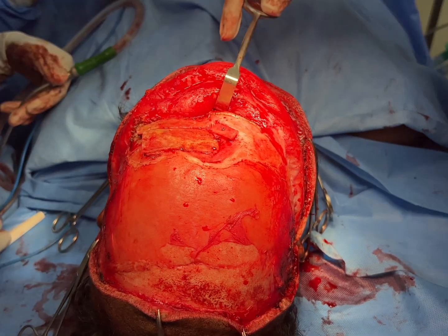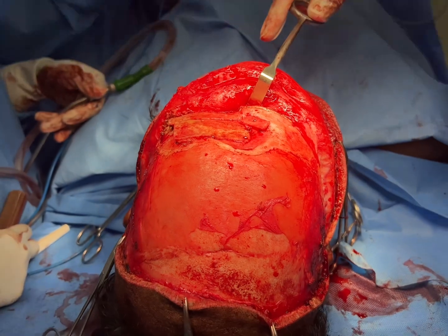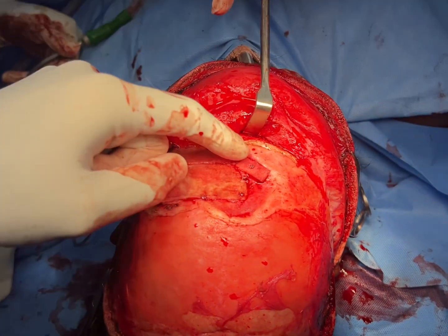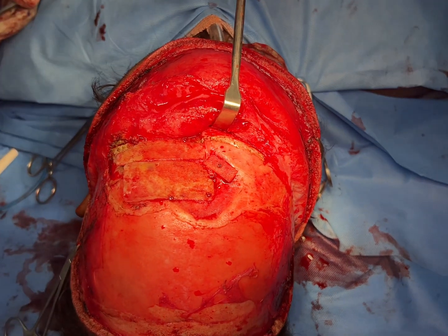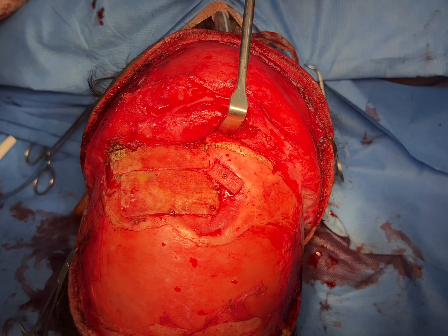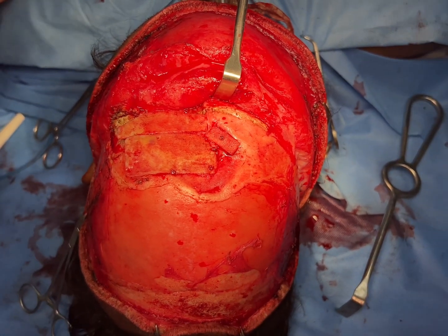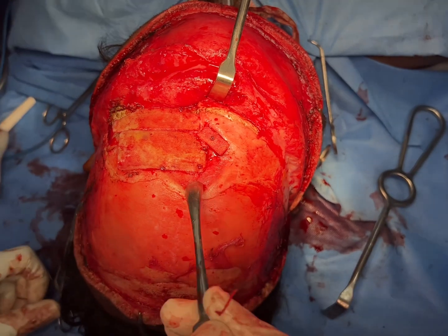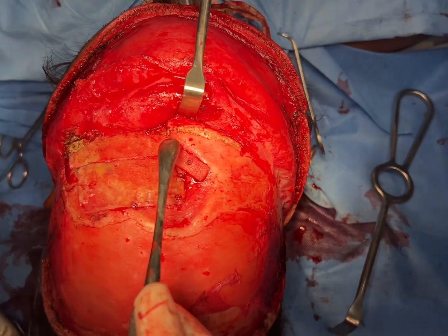What you're seeing here is a redo frontal bone reconstruction. There are lots of implants that the earlier surgeon used almost a year ago, and there's a dent from the earlier fracture. You can see there's a depressed fracture of the frontal bone — there's a depression there.